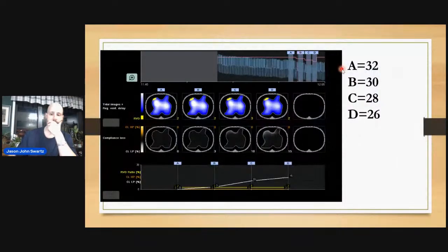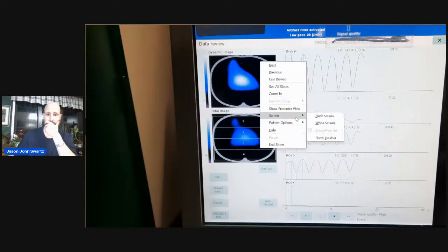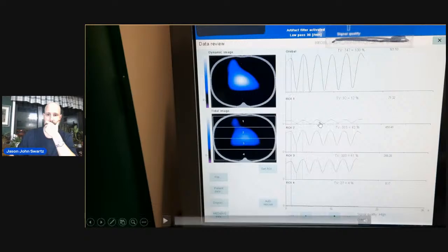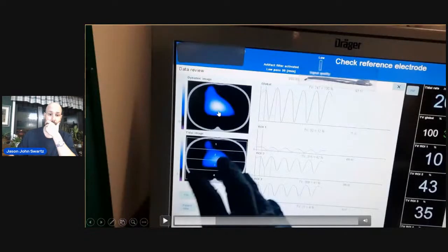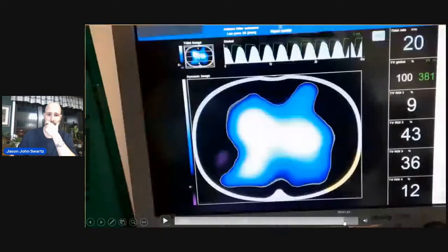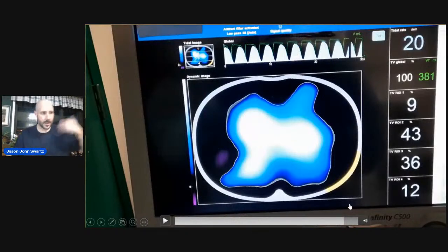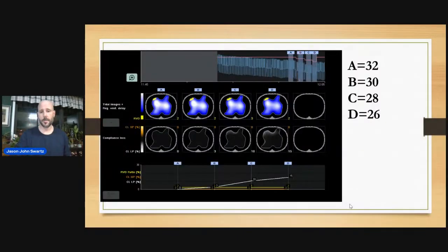So these are really good results. They occur often. That's a huge difference. Okay, prone, APRV, and normal distribution. And this is all within a 24-hour period that these lungs are changing. This is usually by the end of an 8-hour shift.